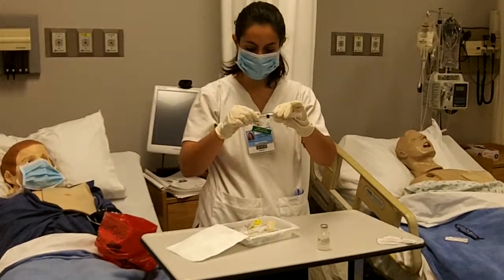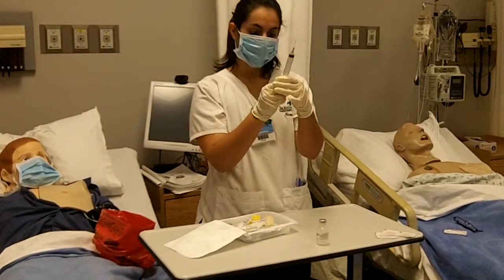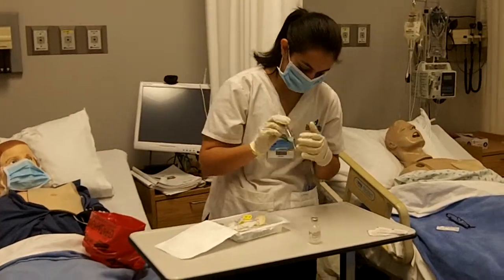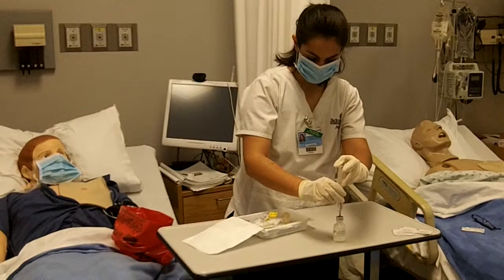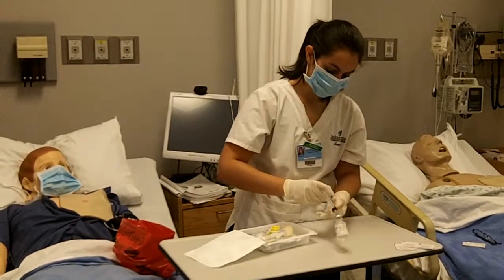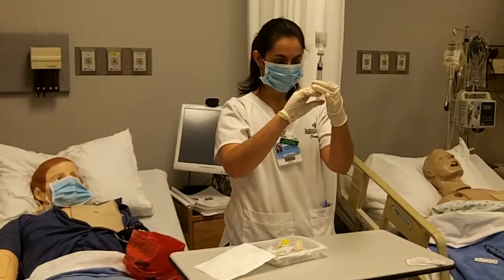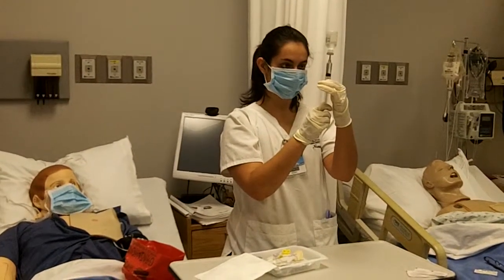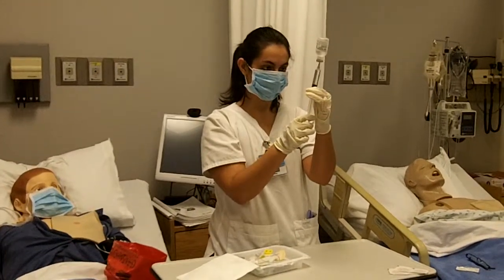Now I would put the needle on my 10 milliliter syringe. Aspirate 10 milliliters of air. And flip the bottle up. And withdraw 10 milliliters of normal saline, making sure to get all bubbles out.